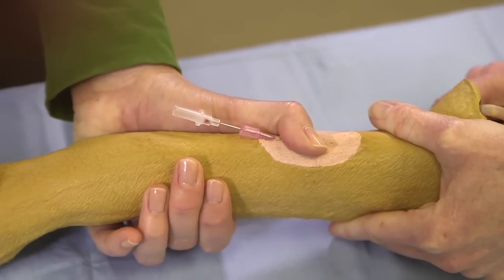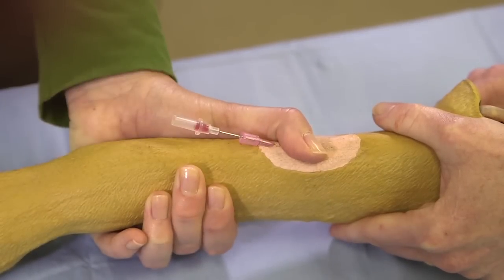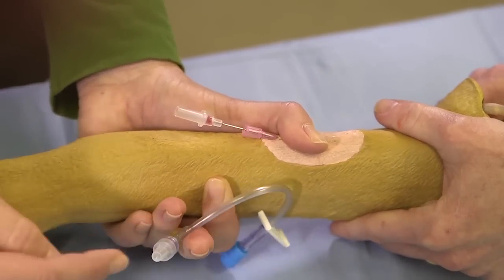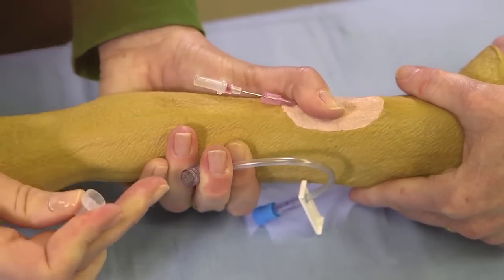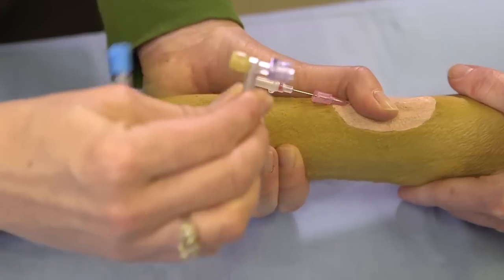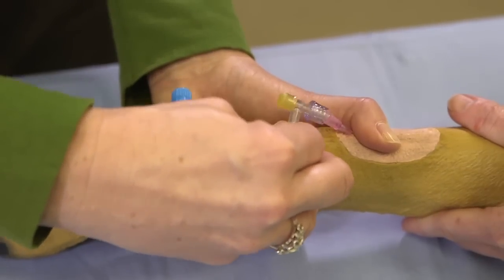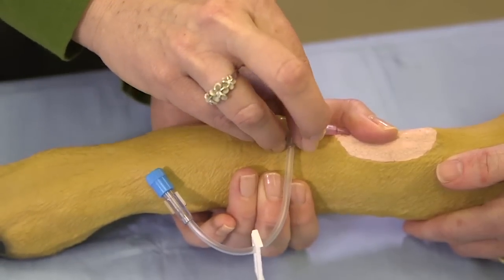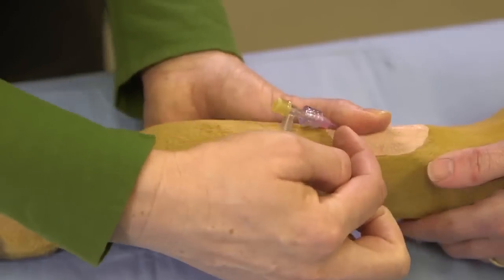I'm going to take my thumb to hold off the blood — you can see the blood is wanting to come back. I'm going to have my T-port ready. This is my T-port; it's going to have a protective cover on here, so I'm going to take that off. This is sterile — don't let it touch anything. Have your T-port ready so that when you pull your stylet out you can place your T-port on. This one has a screw on top, so you have to carefully screw that onto your catheter while keeping everything still.